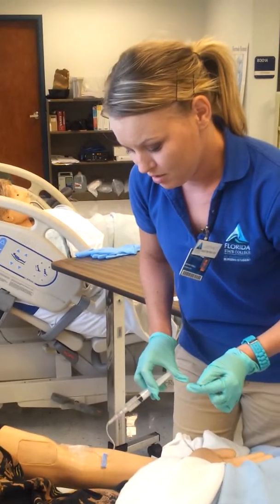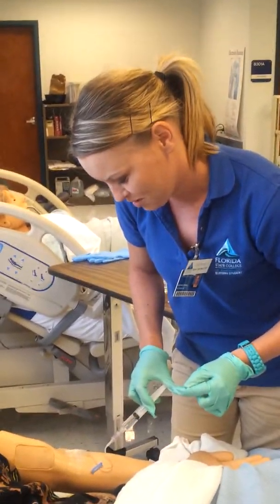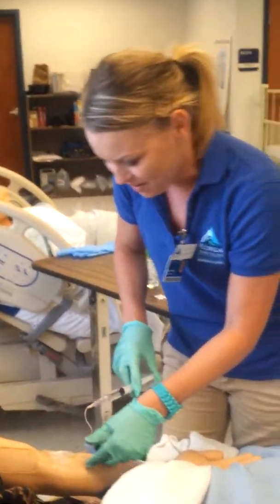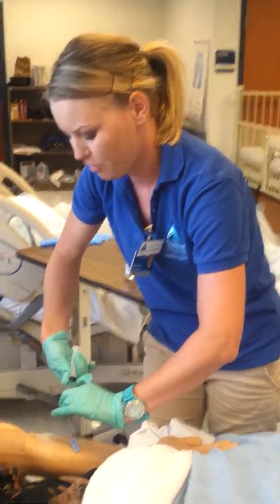I'm going to take my normal saline that I had drawn up and I'm going to administer 3mLs in a push-pause method — push, pause — about half a milliliter with every push. Push, pause, push, pause. And I'm going to clamp it while I have pressure on the plunger. Then I'm going to remove my saline and recap it with the sterile end of the IV device.